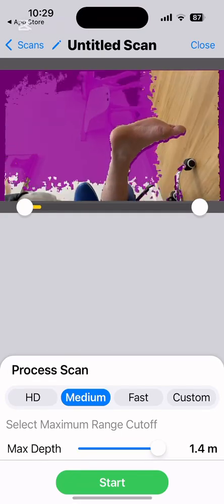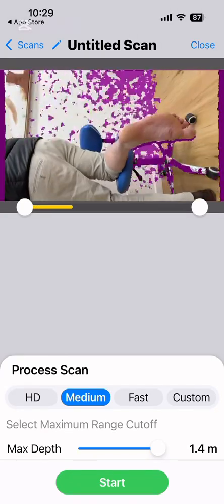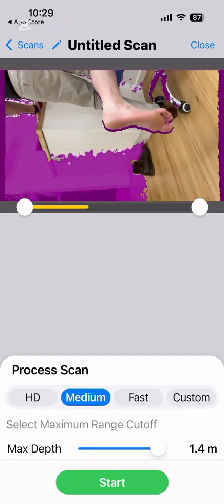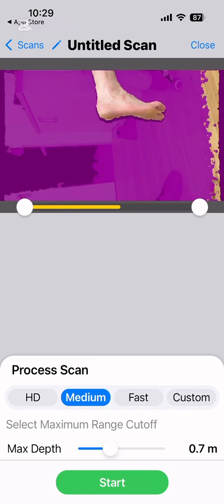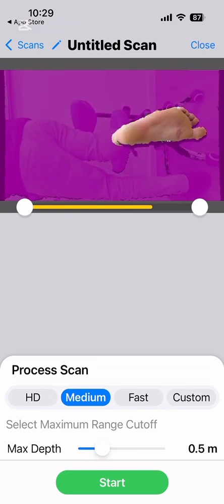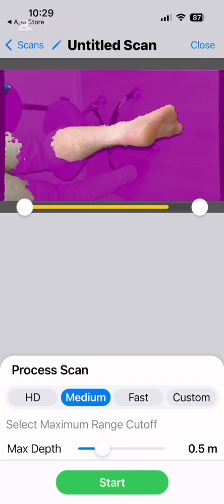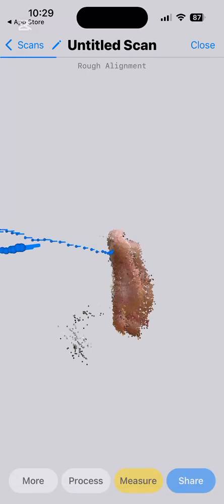You can see here once we've taken a scan of the foot, we can change the range. This is really important so that we get a really good detail of what we want in the scan. So you can see on the image there the purple in the background. As I move the toggle down, anything with the purple will be cut. I've gone a little bit too far there. So for this particular scan, we can cut it at 0.5 and the scan will then do its work.